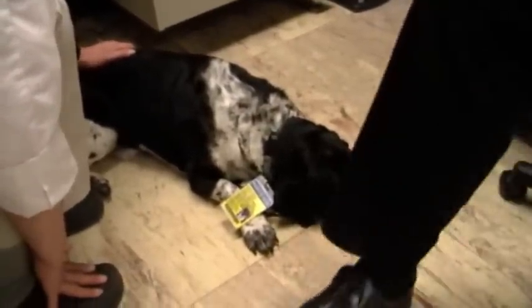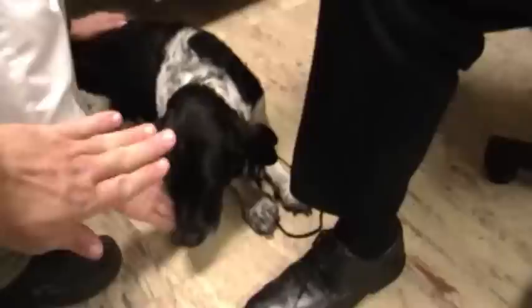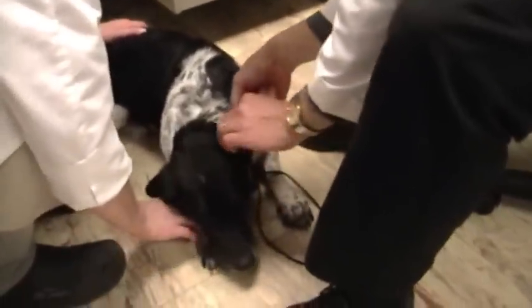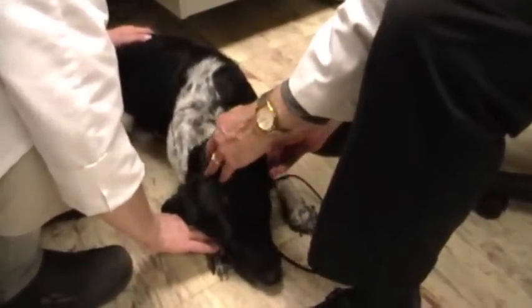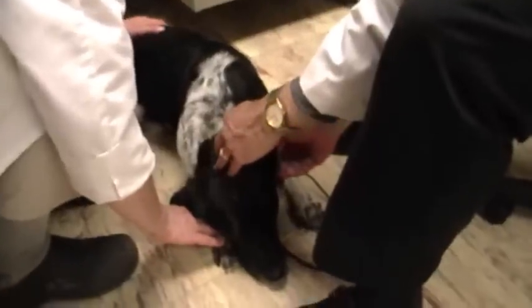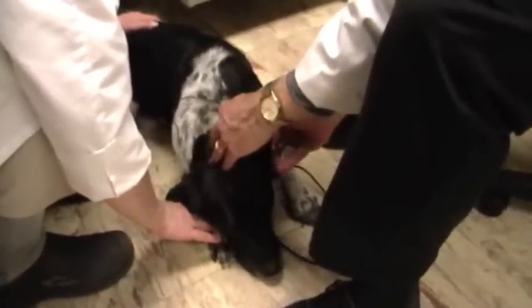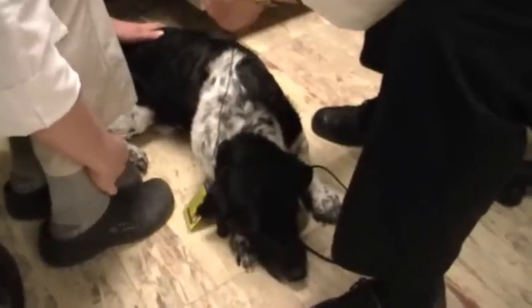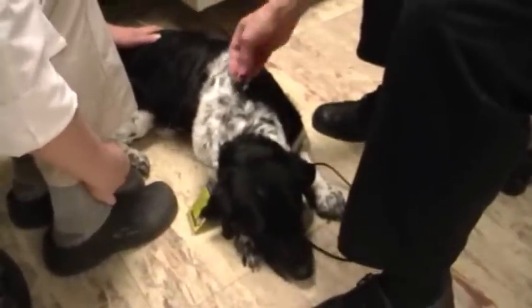Mr. Timmy, how are you doing? I can't hear whistling, I don't think. Now when you reach up to get it out, when your hand's up by the microphone, it can make it whistle. I don't want it whistling — it's just wearing it. Oh, you're such a champ.